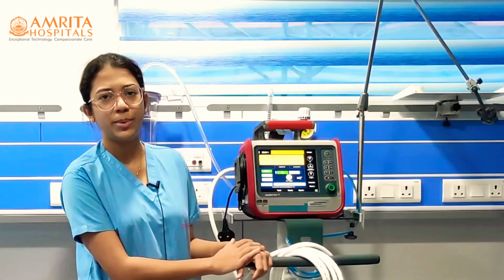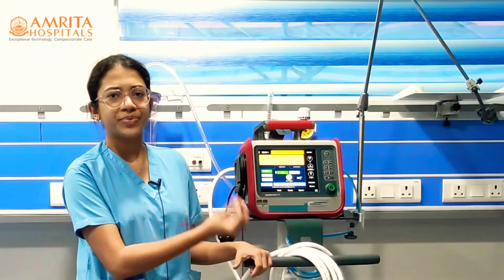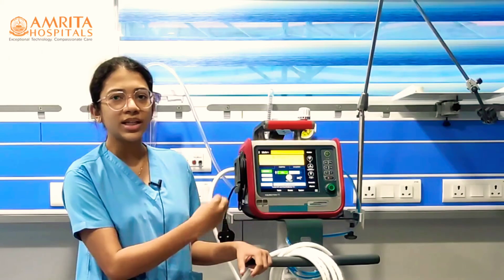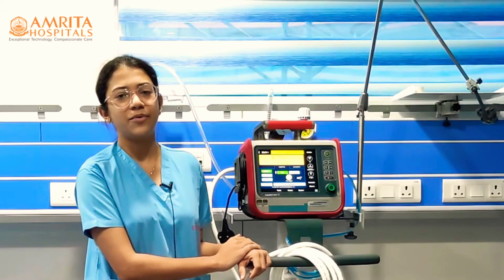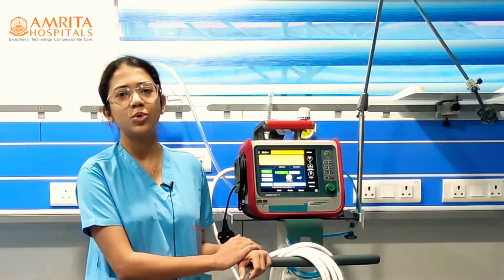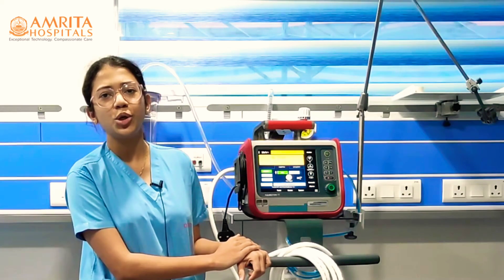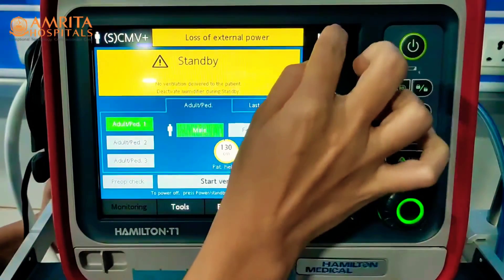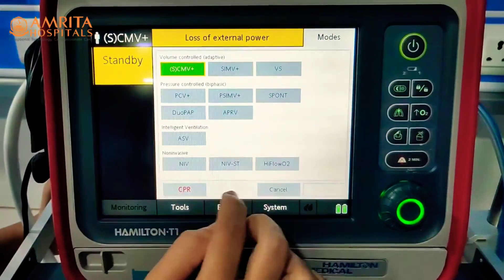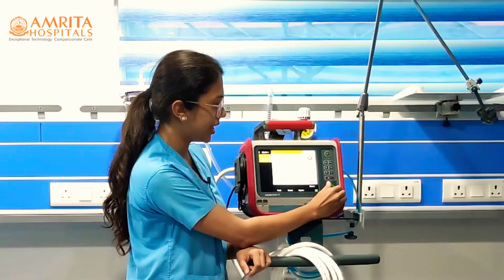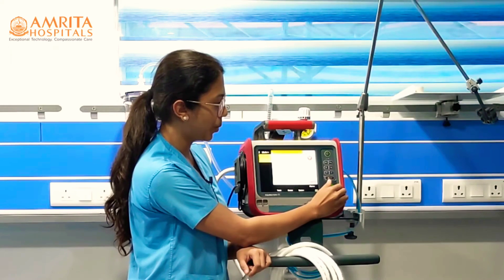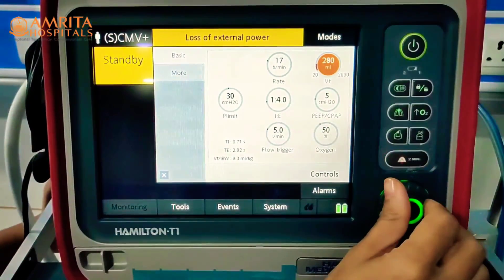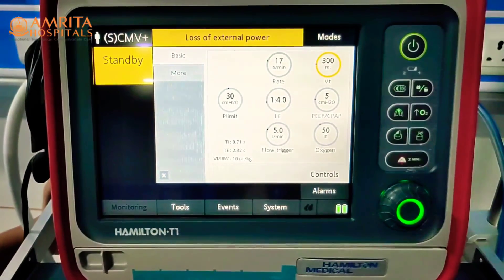When we intubate a patient and set the ventilator, in certain modes we can select the required tidal volume — for example, in CMV mode or SIMV mode. I will show you how to set the tidal volume. Selecting CMV mode and confirming it, I can then adjust the tidal volume by turning the knob and pressing the confirm button. The ventilator will then deliver that tidal volume.